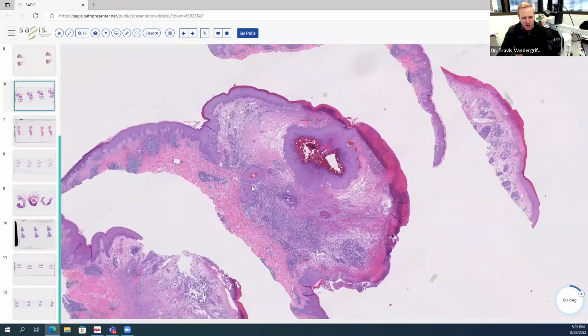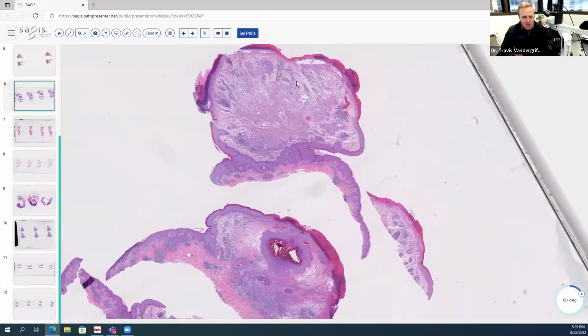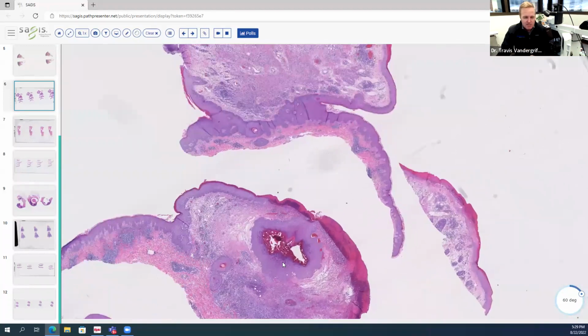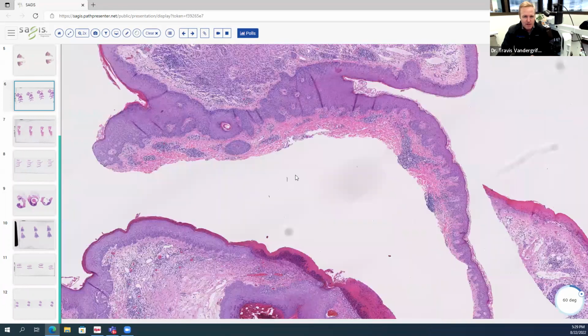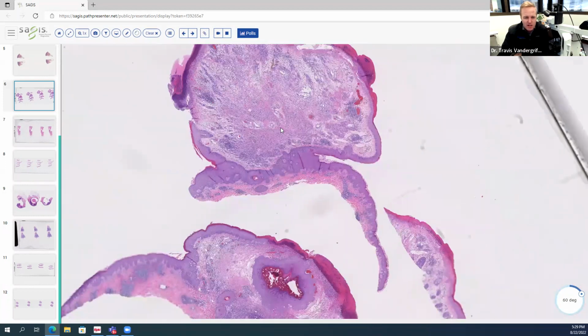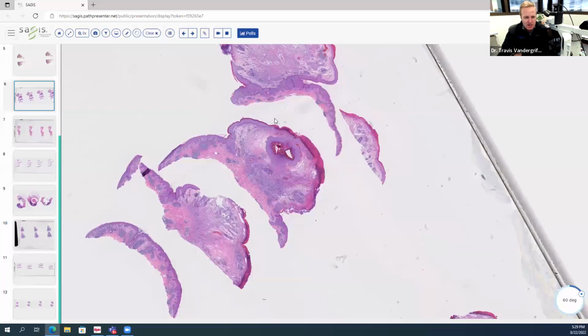So you've actually got three things going on here. You've got a nevus, you've got pyogenic granuloma, and molluscum. And maybe it was traumatized, maybe the molluscum ruptured and that led to the inflammation, but regardless, all three things kind of coinciding, we call that a collision lesion. In this case, kind of an interesting combination of nevus, molluscum, and pyogenic granuloma.